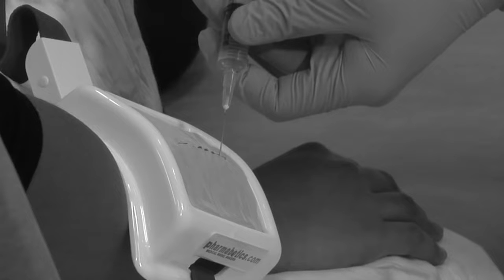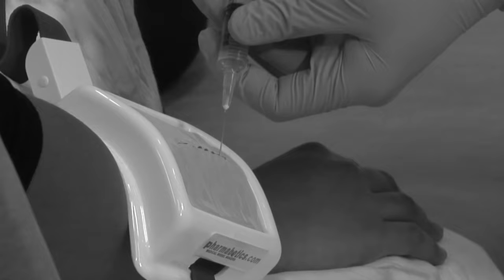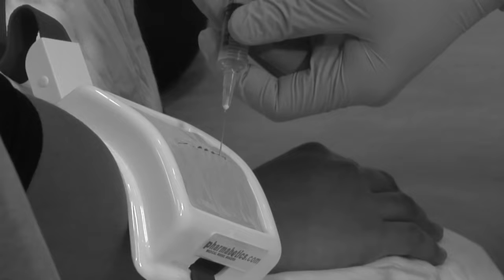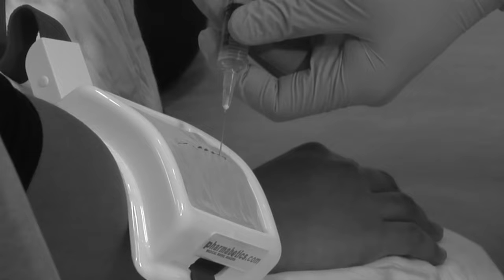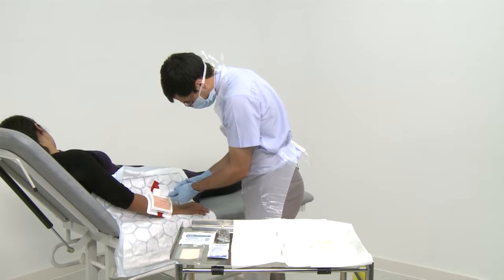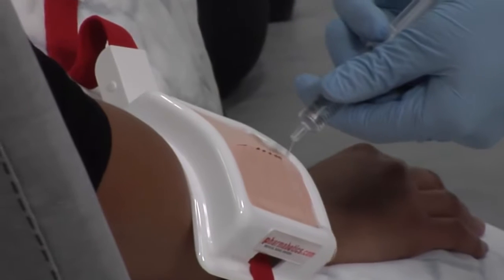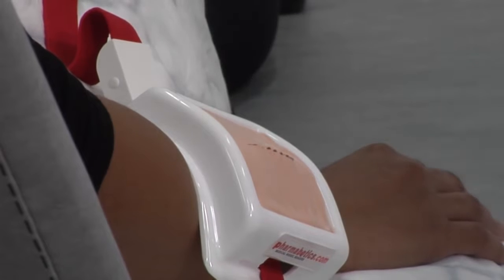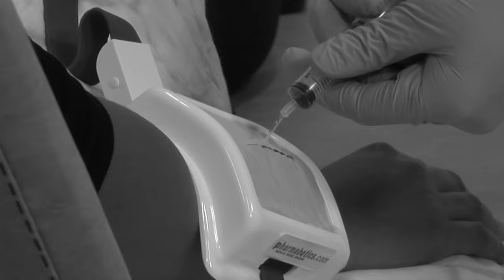The wound can now be explored and cleaned. Meticulous exploration of the wound is essential to determine which structures have been damaged or exposed, and to identify foreign bodies. Particulate matter and contamination must be mechanically removed. If dirt is left embedded in the wound, this can lead to infection or a permanent tattooing effect on the skin. Cleaning is performed with high-pressure irrigation using a syringe, sterile needle, and drinking-quality water. Protective eyewear and mask should be worn in case of splashback. The wound can also be cleaned by scrubbing with antiseptic solution and a sterile nail brush.